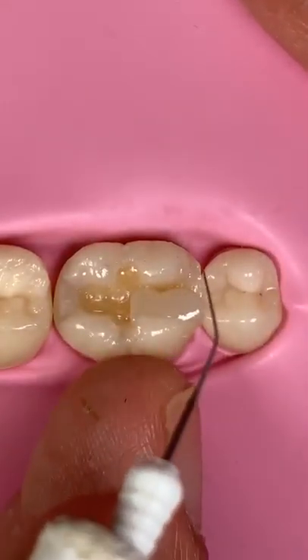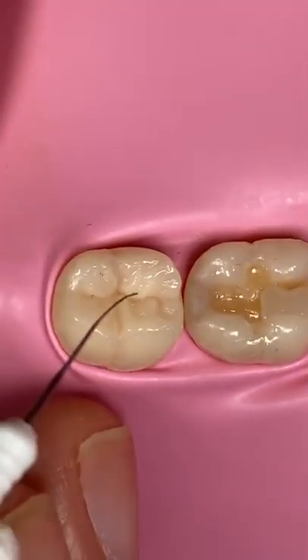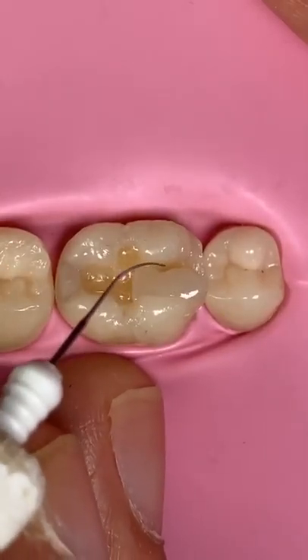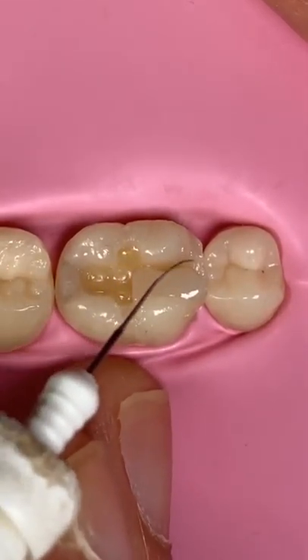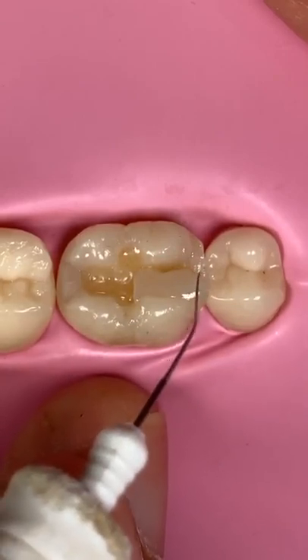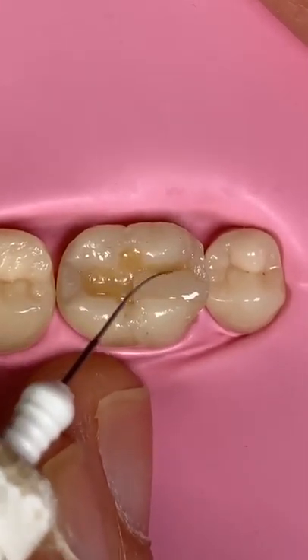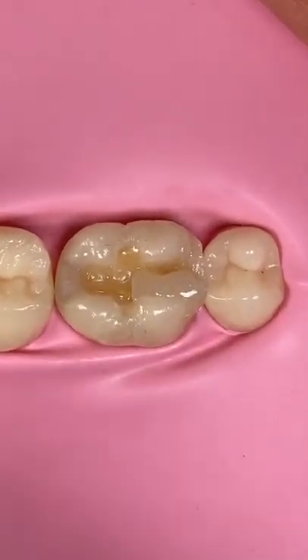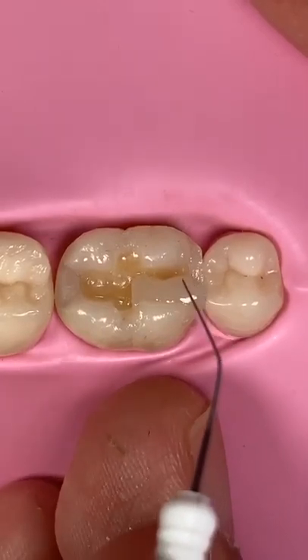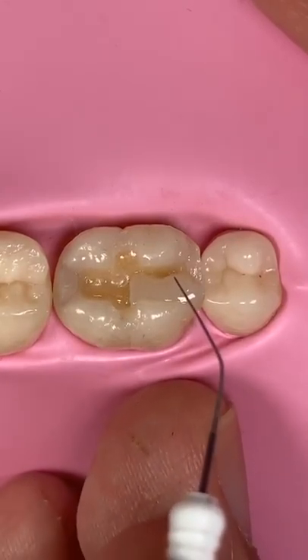if you want it to look very natural, you need to create a little bit of curvy, just like a natural tooth here. See, I will create some natural and curvy. Yeah, this is your carving instrument job. It will do the tricks, trust me, yeah. But since it's number 15, you will not find it really easy to bring all the composite, so you need the thicker one.